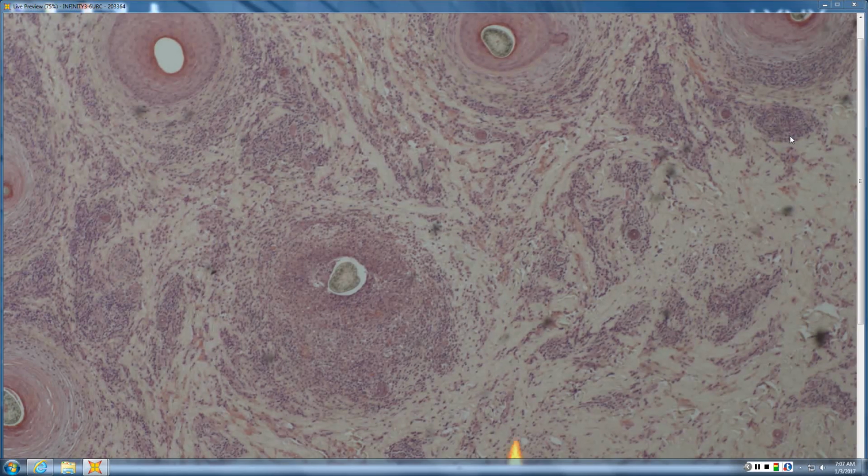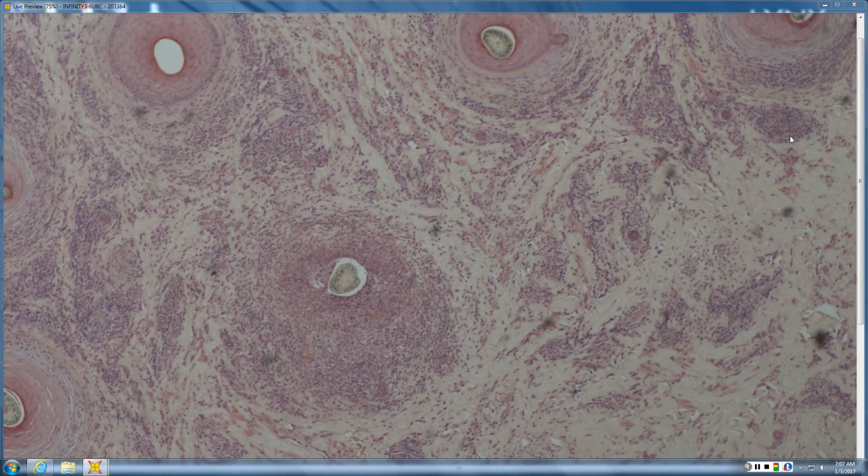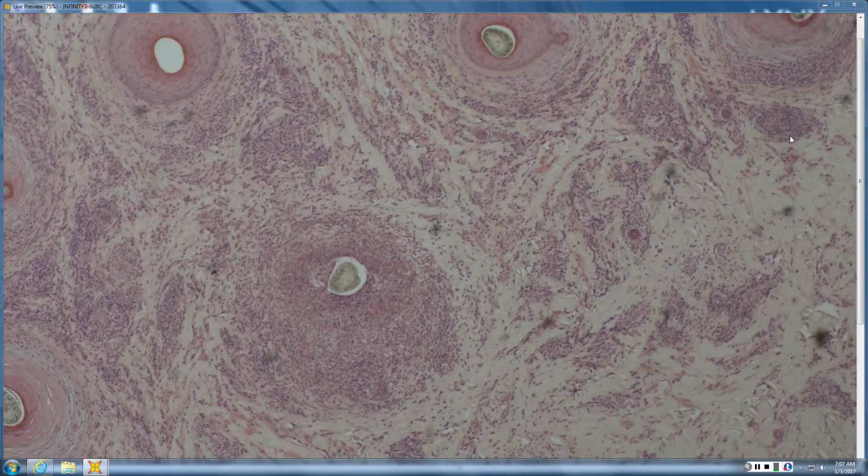You get loss of sebaceous glands. And again, follicular unit dropout, and then you just get tons of suppuration, almost like what you'd see with an AKN picture. Not really seeing naked hair shafts. This is just the obliteration of a follicular unit with suppuration. But when you get that overlap between scarring alopecia and suppuration, that's folliculitis decalvans.